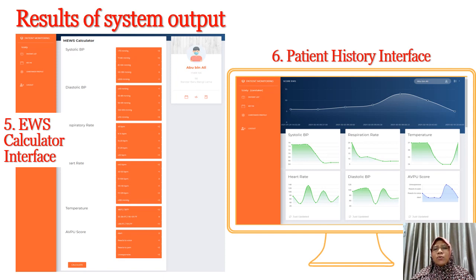The user can also see the patient history interface, where it will display the trend graph of each of the vital signs, for example, the systolic blood pressure curve, the respiration rate curve, and so on.